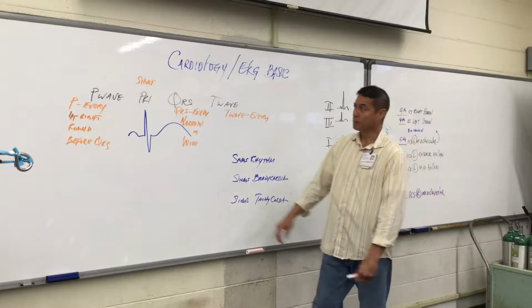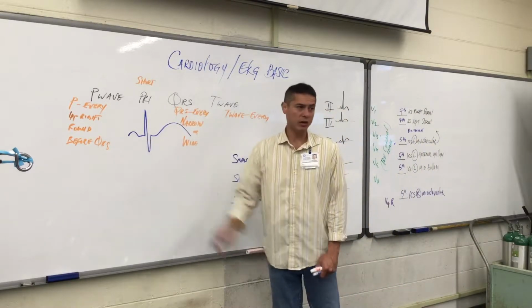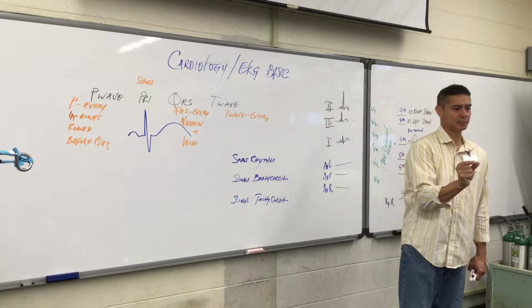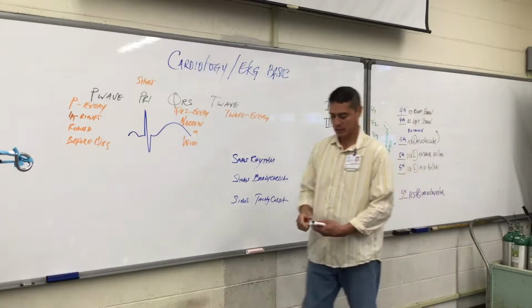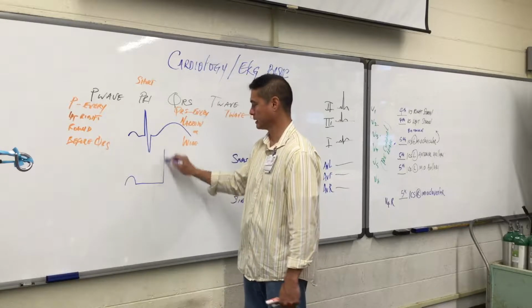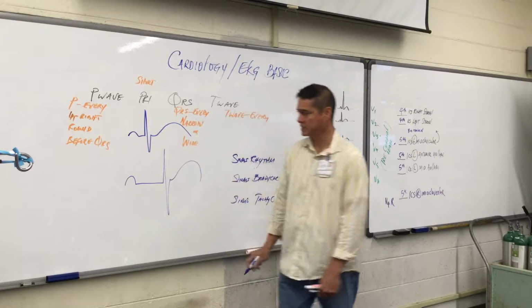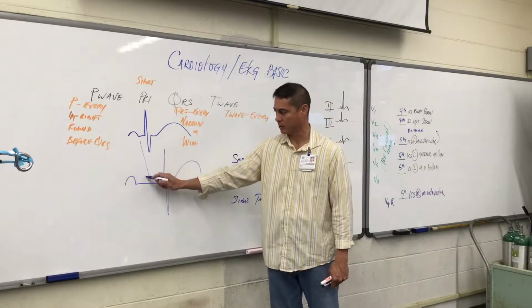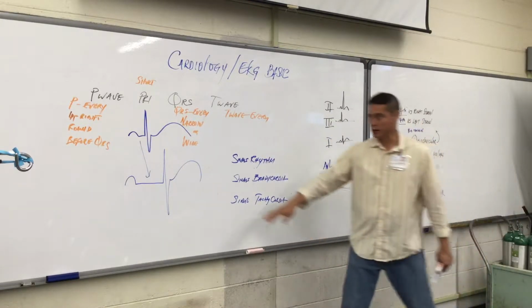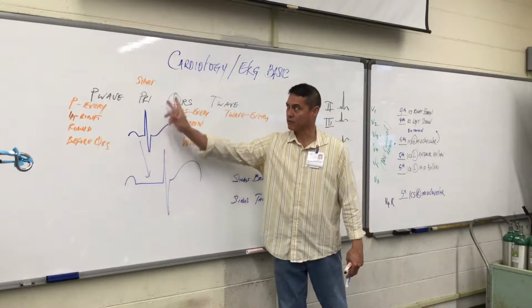The PRI or the PR interval is where, again, we told you that the impulse is kind of slowed at the AV node. Again, this space should be very short. We shouldn't see something very dramatic on the EKG where this space is. I really drew this comically large. But we would like to see this being very short.